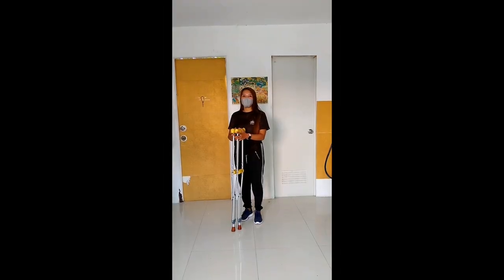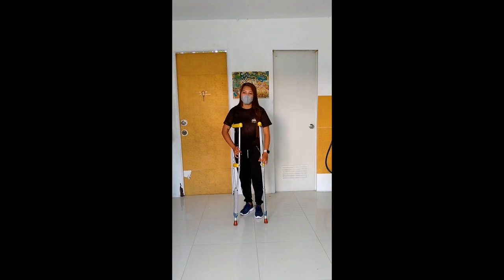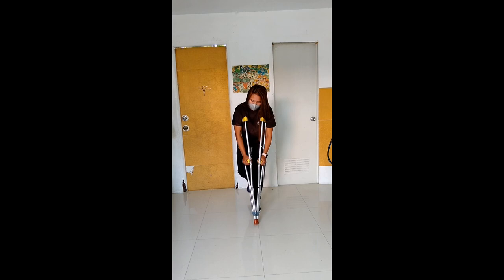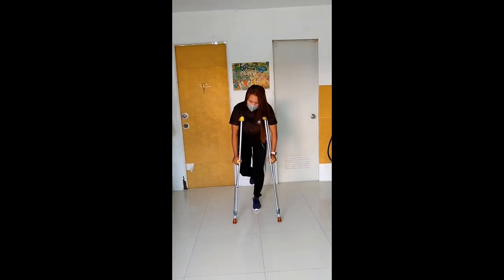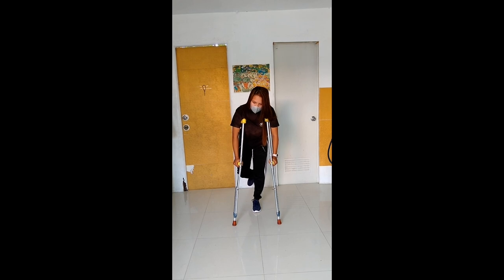Ang next way natin ay yung 3-point gait. Ito po yung panginyari na ito yung sampa. So, isa na yung sampa. Maupunan po yung left and right crutches nyo. Tapos susundan niyo po na pag-akyat ng sampa.